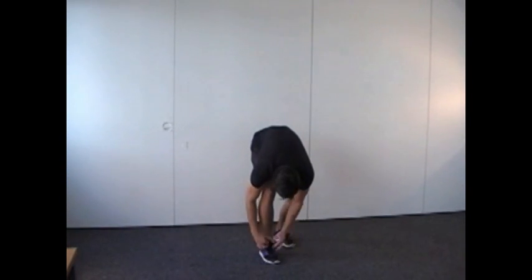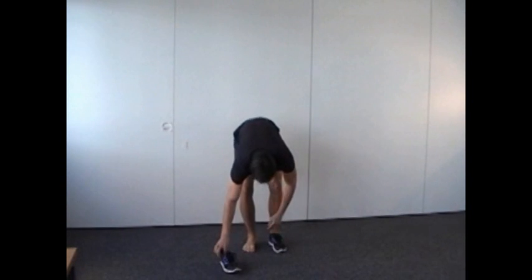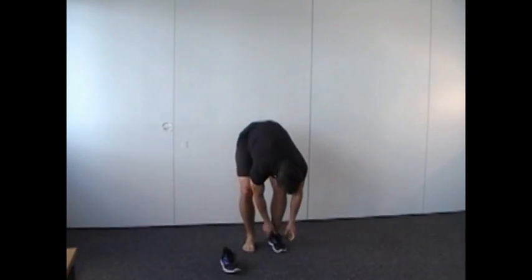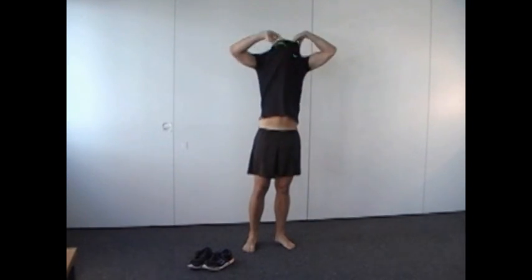Ask the participant to remove the shoes and to unclothe the upper body. For the assessment, it is important to ensure unhindered access to the entire spinal column from the 7th cervical vertebra to the 3rd sacral vertebra.